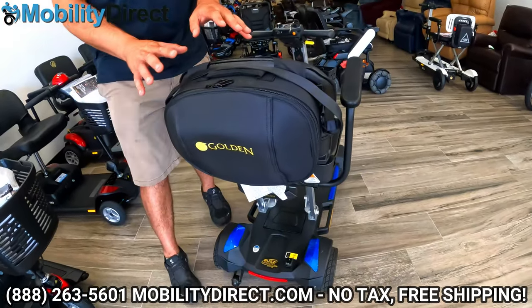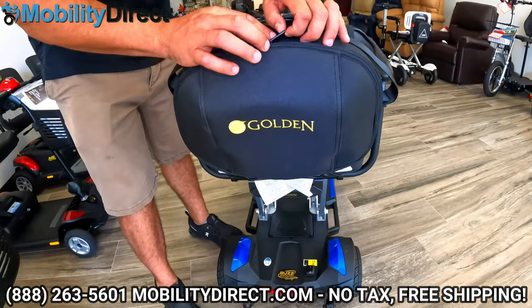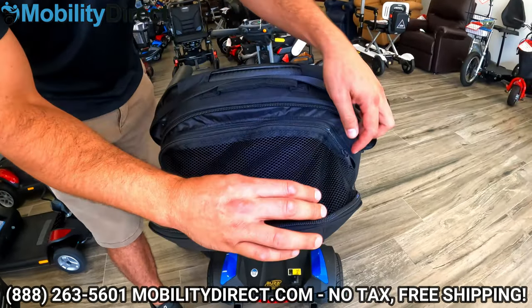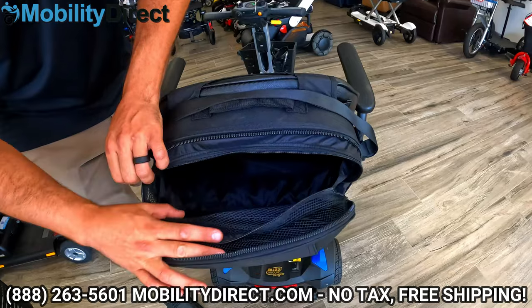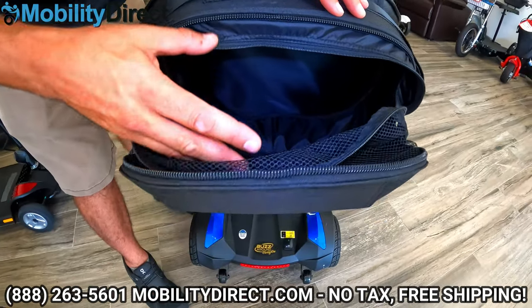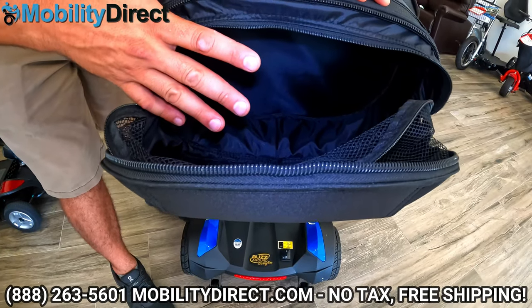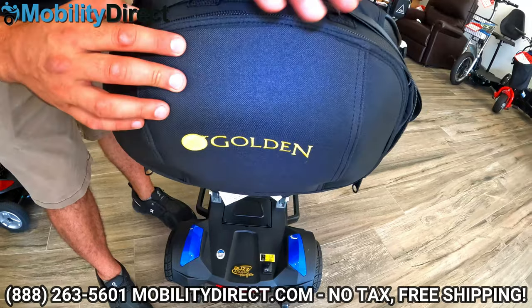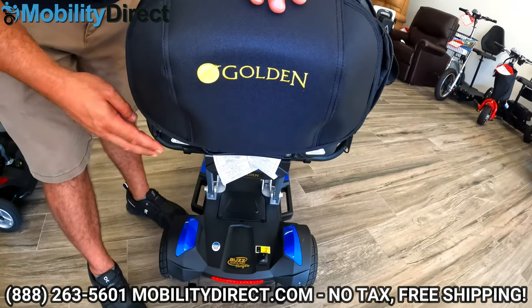On the back of the seat, this is an optional accessory but it's pretty nifty — it is a storage bag, kind of like a backpack that attaches to the back of the seat. It's a clamshell style soft case. You can definitely put a few bottles of water, a meal, your purse, your wallet, and some personal belongings in there. It's got a nice little Golden Technologies insignia on it.